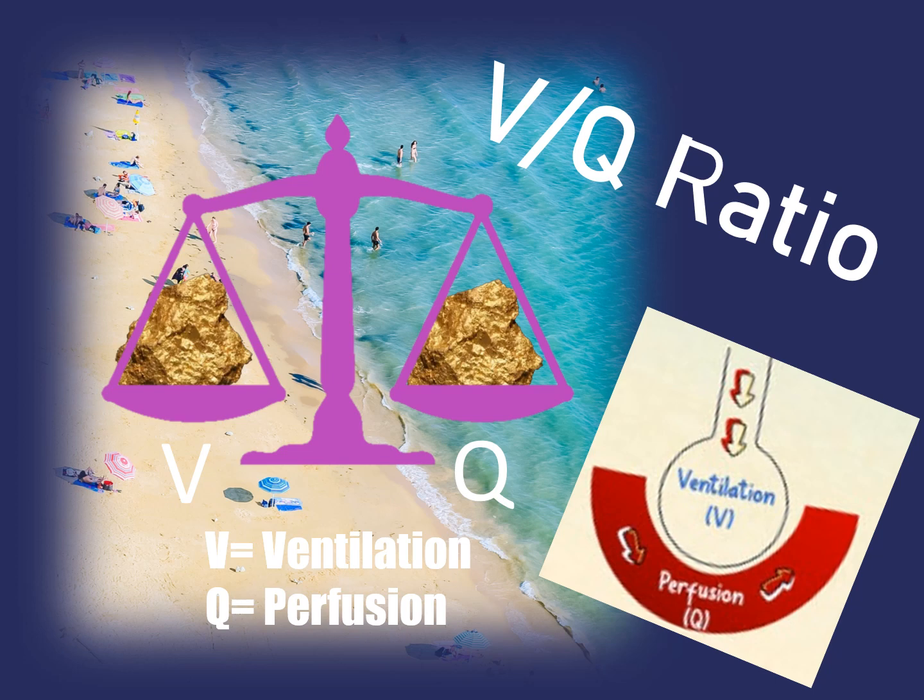Understanding the VQ ratio is the gold nugget of capnography. In order to have CO2 transported out of the body, we need adequate ventilation and adequate perfusion. Alveolar gas exchange depends on both the ventilation and perfusion of the alveoli. So this is the VQ ratio, and it needs to be equal.